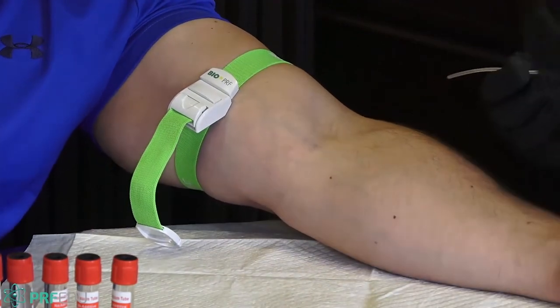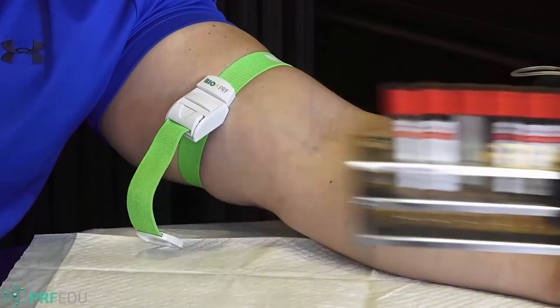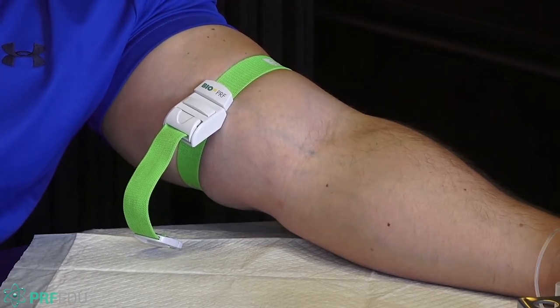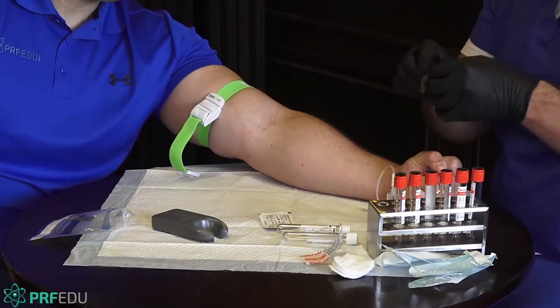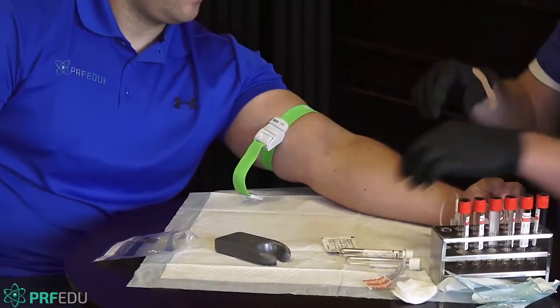When we draw, we always draw the white tubes first, followed by the red tubes. So I'll go ahead and get that all ready. I'll probably put it right here just so it's closer to me. And of course, with the Band-Aid, we always get it ready to put over. What I typically do with the Band-Aid is I'll actually take it out of the package and just put it on my glove so that it's ready to go. Just makes life a little bit easier. Put it right here, and we just let it hang there so that we're ready.